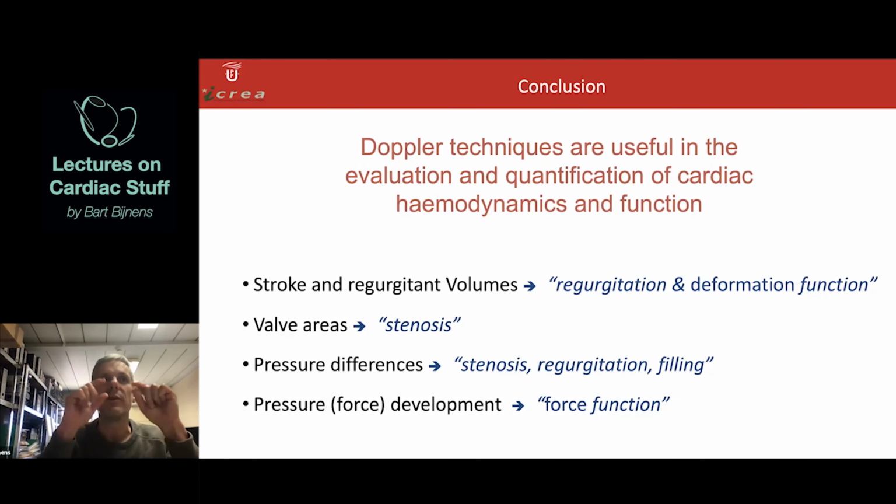One thing is, for example, the sample volume that you're using for Doppler. And the sample volume and even the spatial resolution, especially the lateral resolution or the in-slice resolution of ultrasound, is not so great. We could indicate this error, but the problem is that the companies are not eager to show how bad their systems are in some ways. So in that sense, it's not being done explicitly.